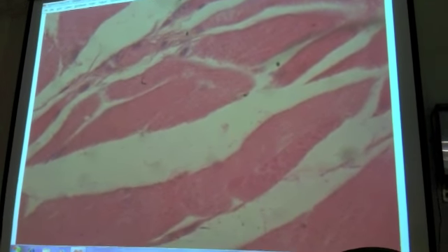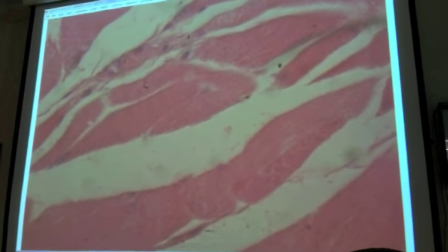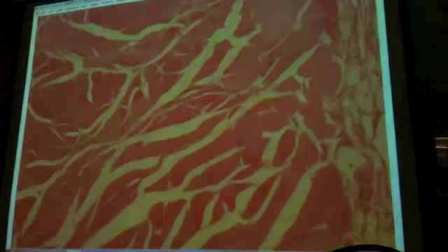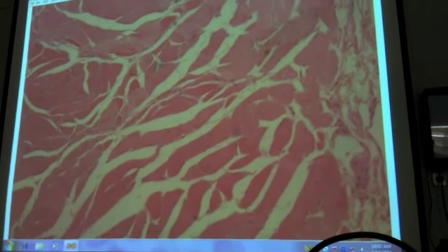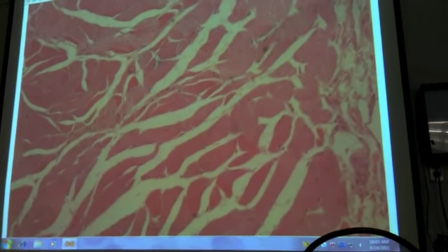So are we in the upper proximal esophagus or are we in the distal? We're in the proximal esophagus, also known as the upper esophagus, yes. So if it has the glands, does that mean that it's in the upper and it'll have skeletal muscle? Yes. I didn't write that on here, but we're going to find the glands associated with the skeletal muscle, and that's the upper third, okay?